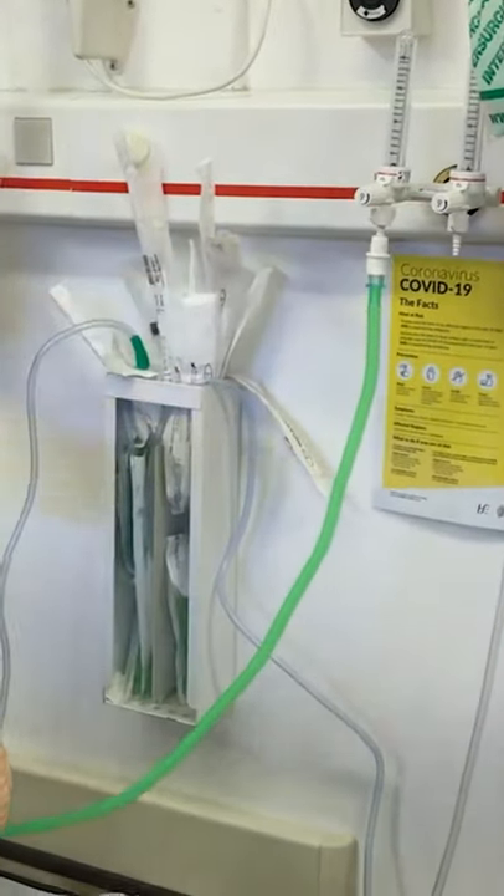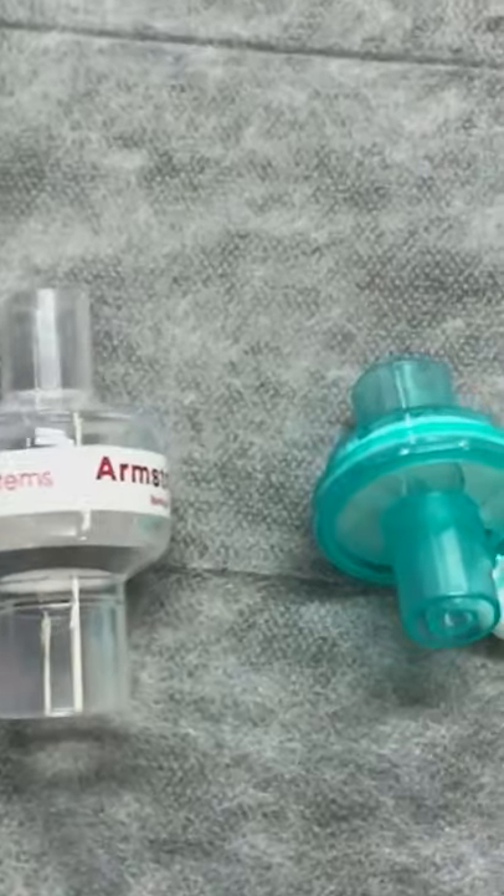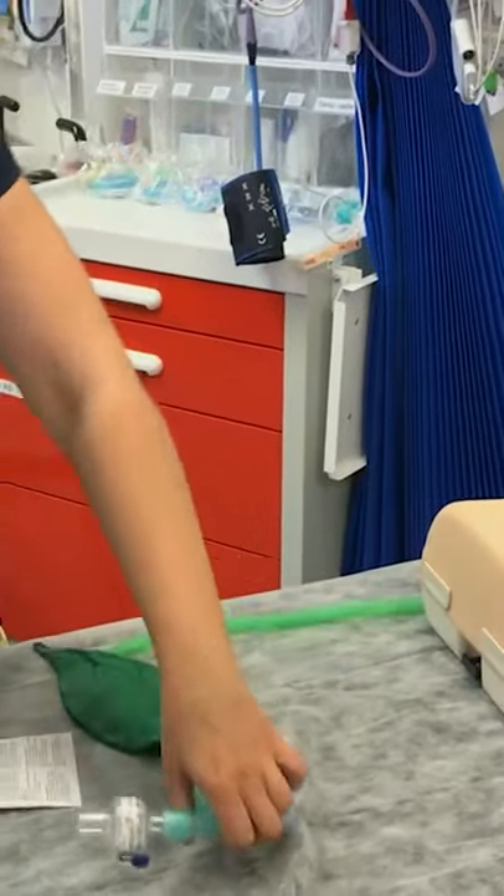Inflate the cuff of the mask with some air, as that allows you to get a really good seal. Then attach your bacterial filter and attach that to the C-circuit.